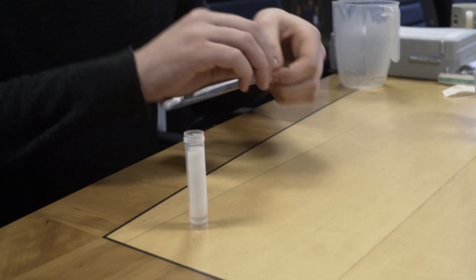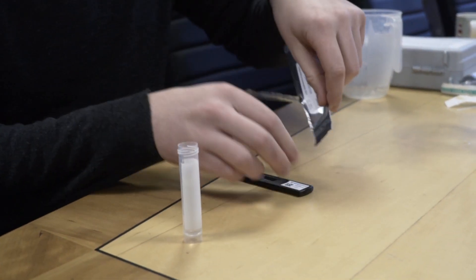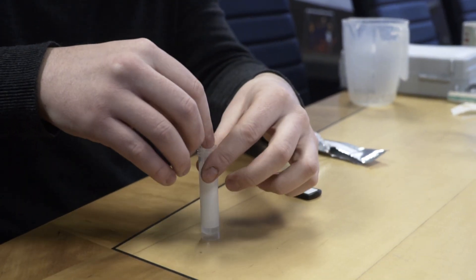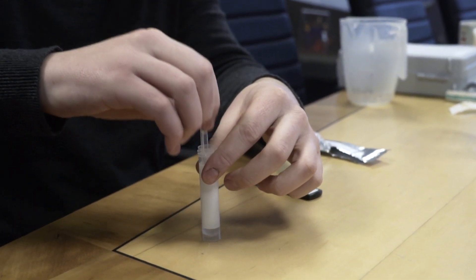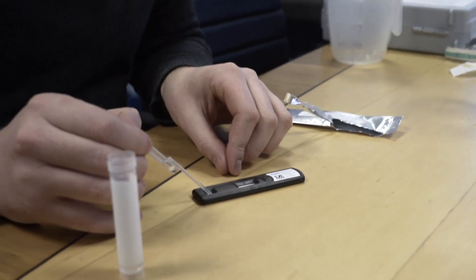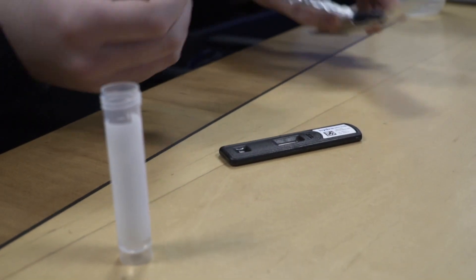What we're then going to do, exactly as the other test, is take out the test strip and use the pipette to take a sample, put it on exactly the same point, and again leave that for just 25 minutes — and that's it. We'll be back in 25 minutes when we've got the results of both samples.